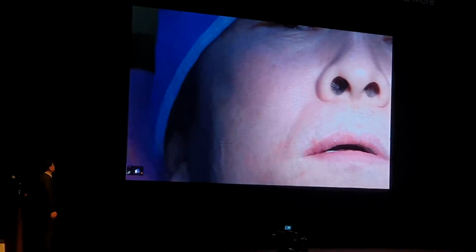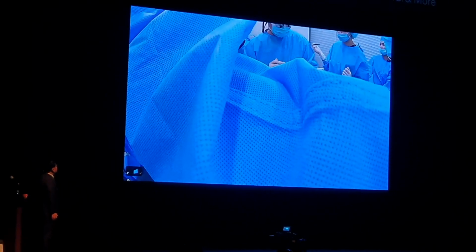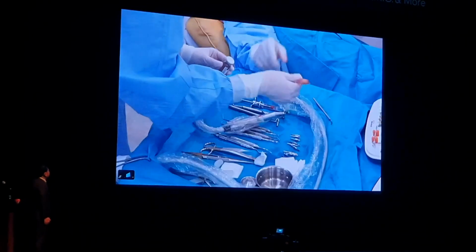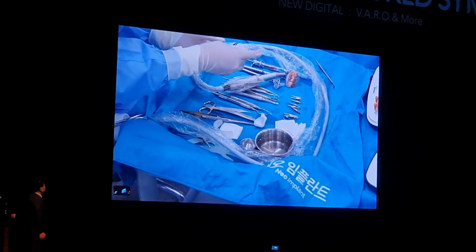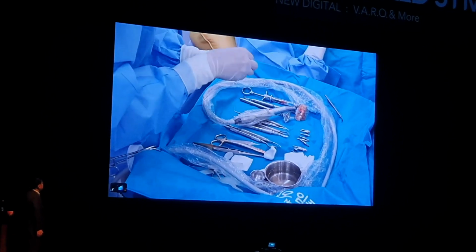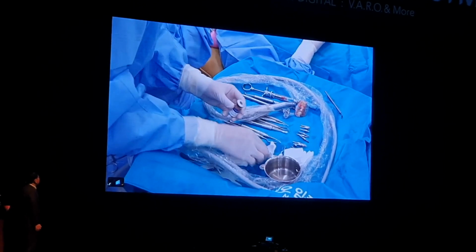Okay, I'll do the bone graft. So please do me the bone graft. I'm gonna use the DM bone. As you know, it's an alloplastic bone substitute material.